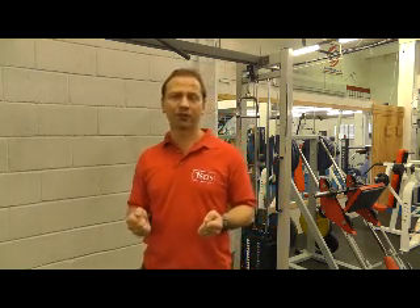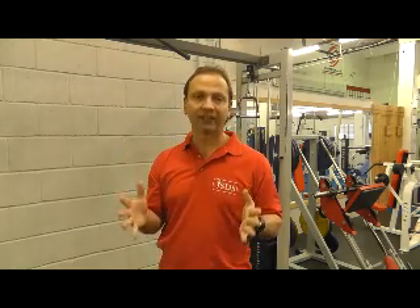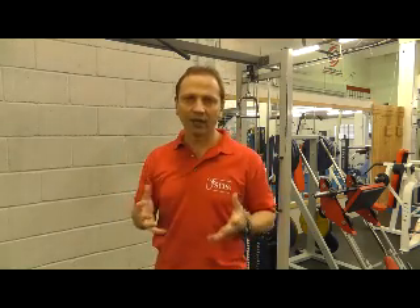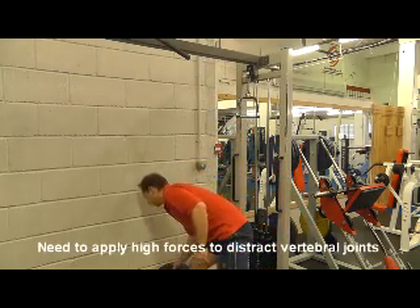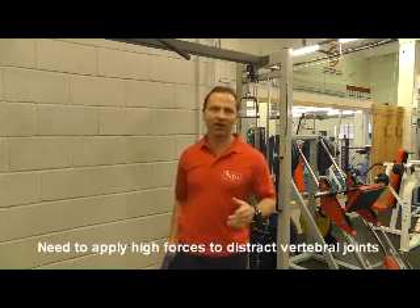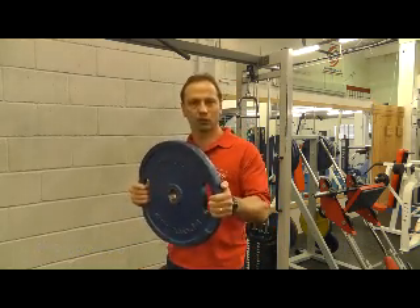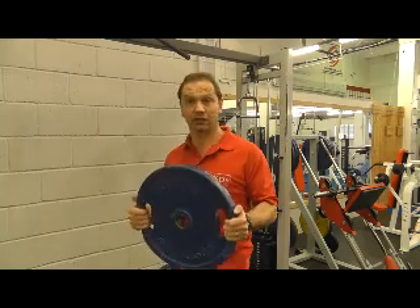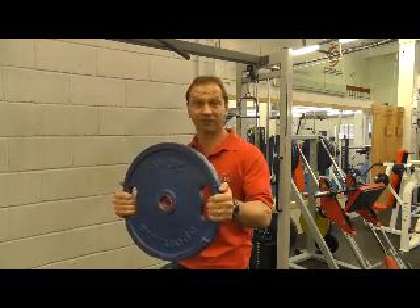That force — around 30 to 35 kilos — is considerable, and it's being applied cyclically for 25 minutes. To do that manually is extremely difficult. To illustrate what these weights actually look like: if somebody weighs 40 kilos, this is the corresponding 20 kilo weight. That's actually quite heavy — I can hold it but I'm already starting to feel it.